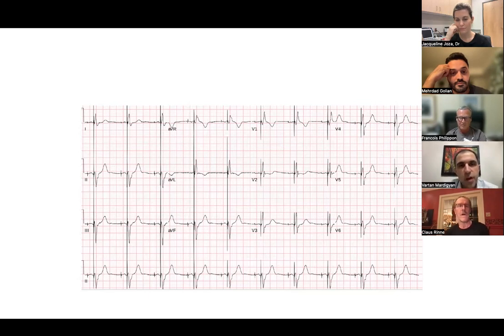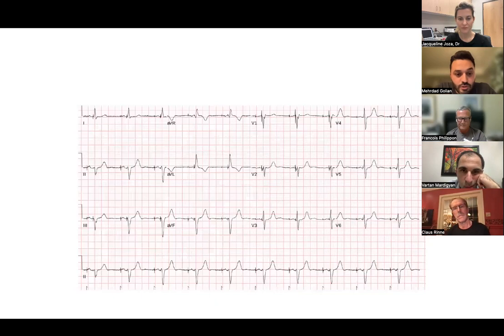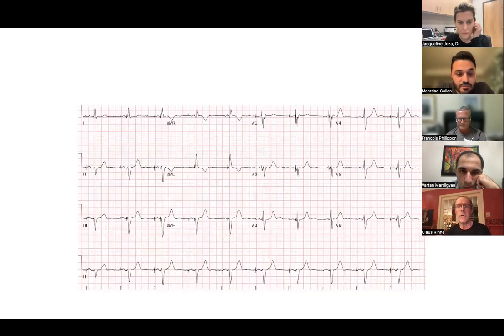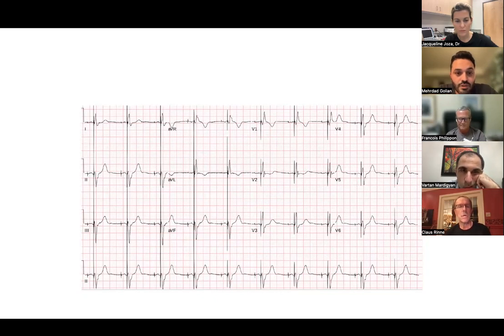Yeah. But it's a very nice result. Like AVL, it looks very nice. Beautiful. But I wanted to show it because on bipolar, you get the septal pacing, whether you get the recruitment on both sides or whether you're actually just getting one side. And then you go to unipolar, you get that nice right bundle looking thing, with, again, LVAT not changing much between the two. But it was more aesthetic. Let's go back one more time.